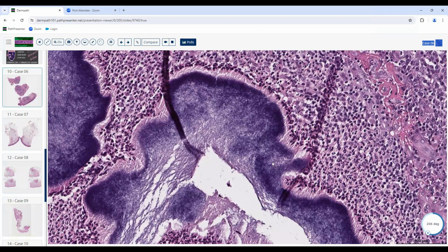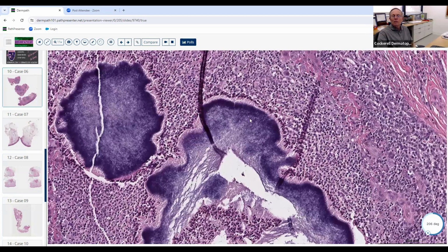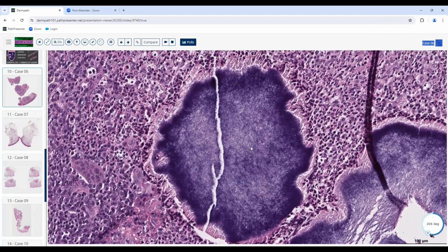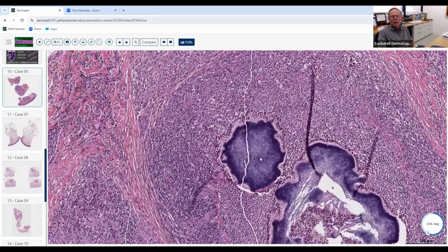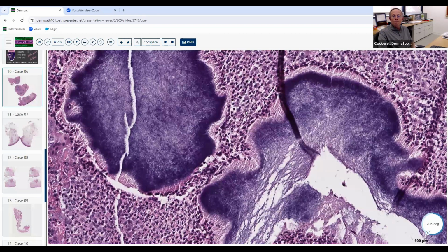Okay. And what's the only other disease that we see in dermatology that gives you grains like this? Other than botryomycosis, actinomycosis, and maduromycosis, there's one more. Nocardia? Yes, Nocardia. Those grains usually don't give you this many organisms, this filamentous. When you see those, they almost look like a little pink glob of protein. So this looks really good for Actinomyces. It's one of the best ones that we've had here in a long time, so it's a really good example of that.